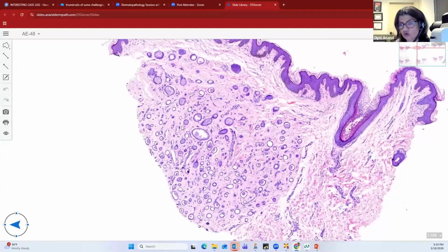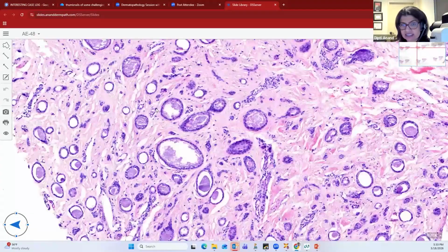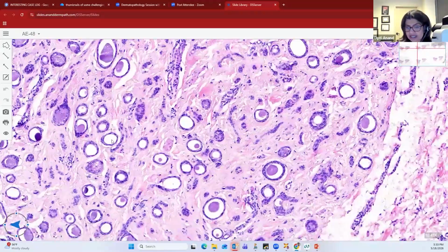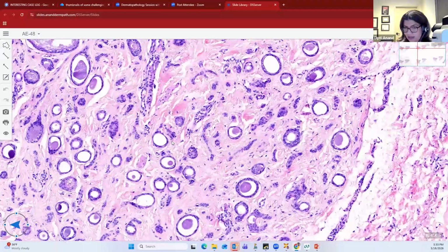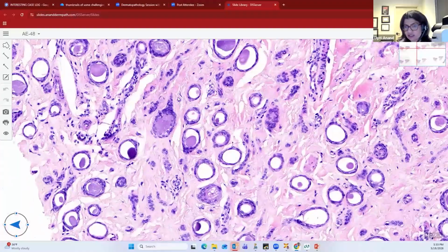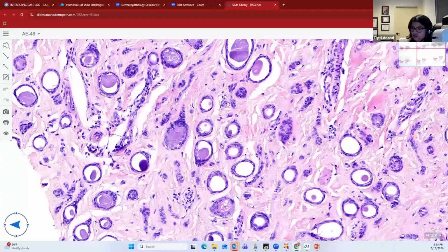The important thing about a syringoma is that the stroma is an integral component. So you can see this nice, beautiful stroma, which is sharply demarcated from the adjacent dermis. Within the tumor itself, you will see these tadpole-like structures. So you can see these nice ductal elements which have secretions within them, and then these nests and cords. And in places where those ductal elements and the cords are fused, these will form these tadpole-like structures. So that is your syringoma.